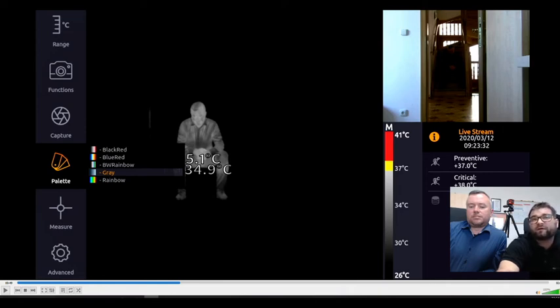We have one more video where we again played with the blackbody source temperature, and you will see how it looks in case somebody has a higher temperature.